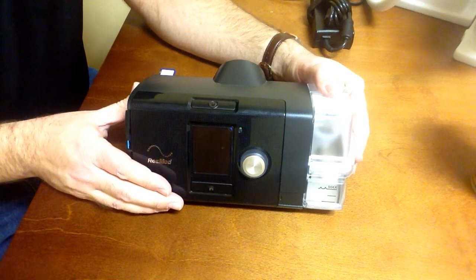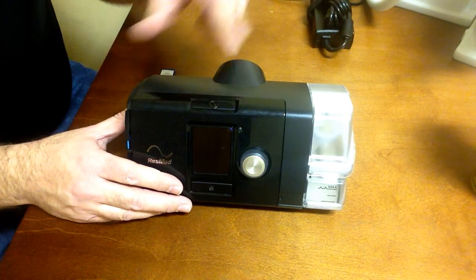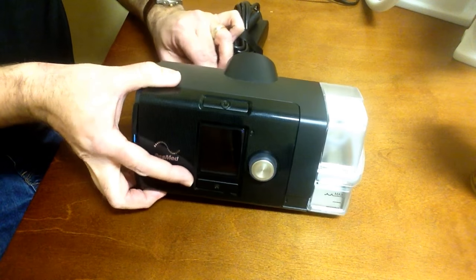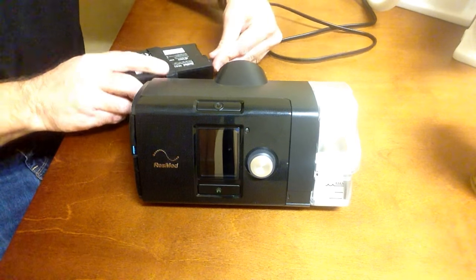With the AirSense 10, after you plug it in, simply press the start-stop button on the top of the unit to start the device. I'll plug it in here so you can see a few of the basic functions and how to use them.